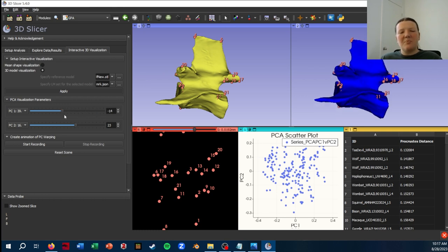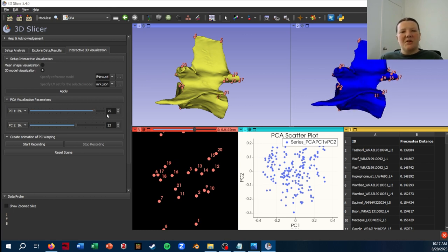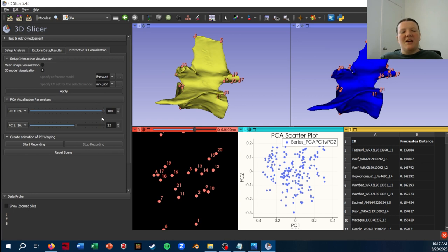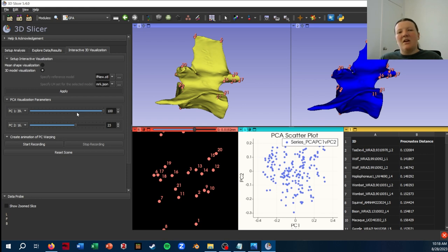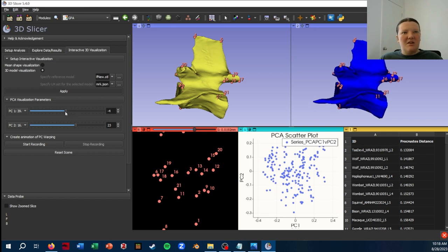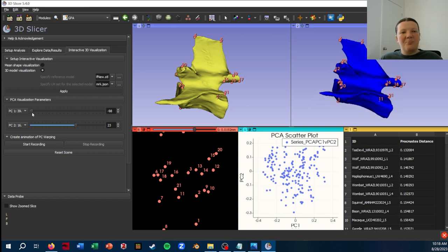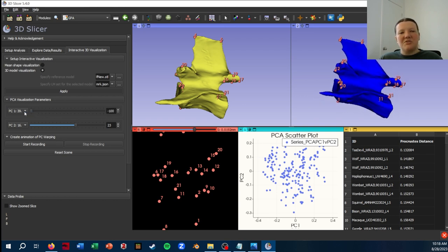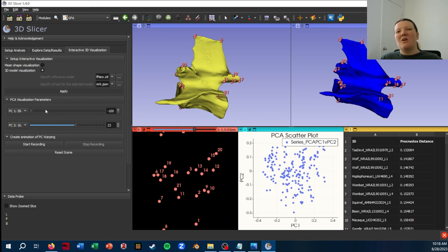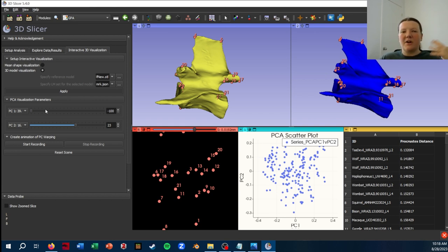Just to quickly point out, you might notice that the actual value here, 100, does not line up with the value here, 0.4. That is because this is a scaling factor and not the actual PC value. So my understanding is that it's essentially your 100% of the way along PC1 in the negative direction or positive direction.